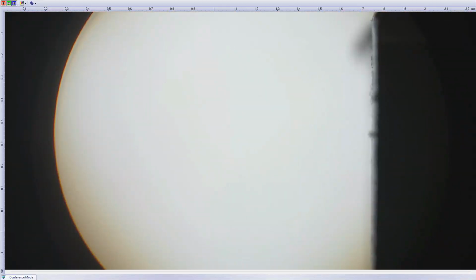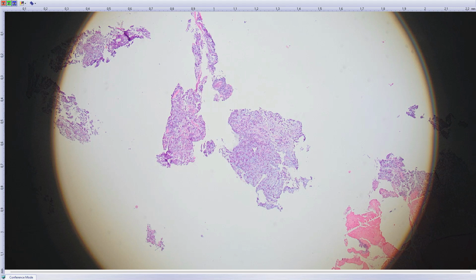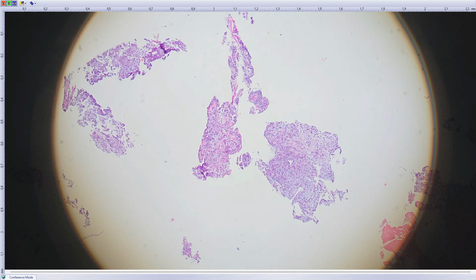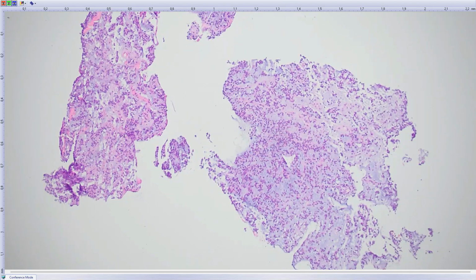So this is another brain tumor. It's a child case. It's a 6-year-old female. Again, location, I don't know the location, but based on what I know now, it's probably a supratentorial lesion, and maybe located somewhere next to the chiasma opticum or somewhere in that region.